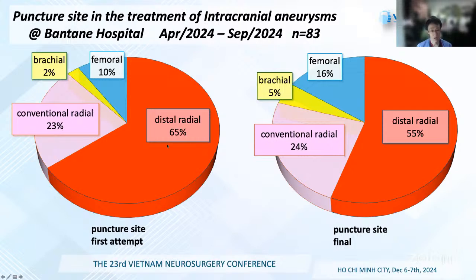About 65% of cases we try to do the distal transradial approach, but some of them failed and we converted to the conventional radial or femoral approach.